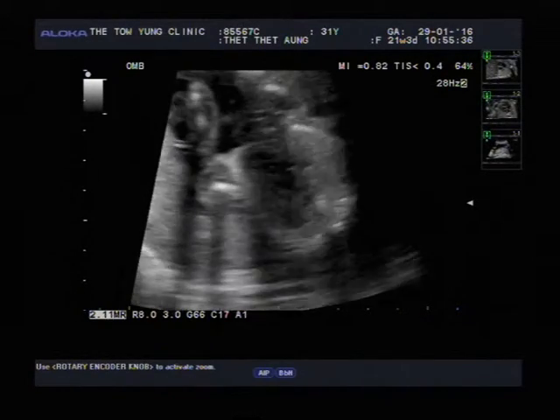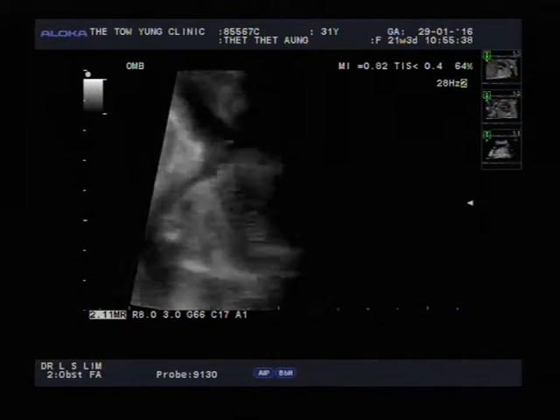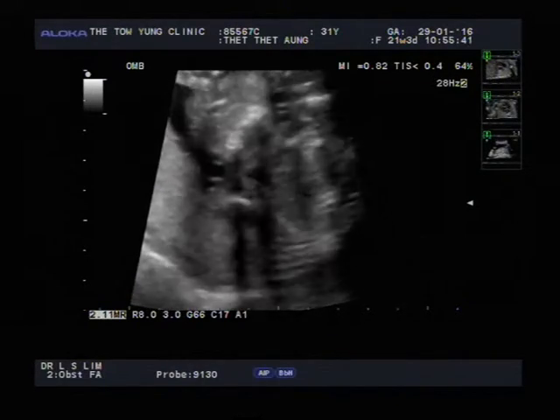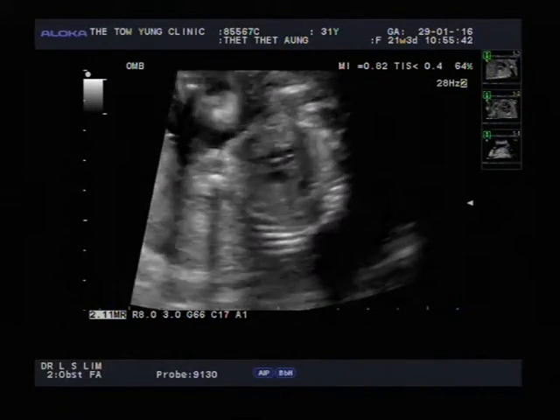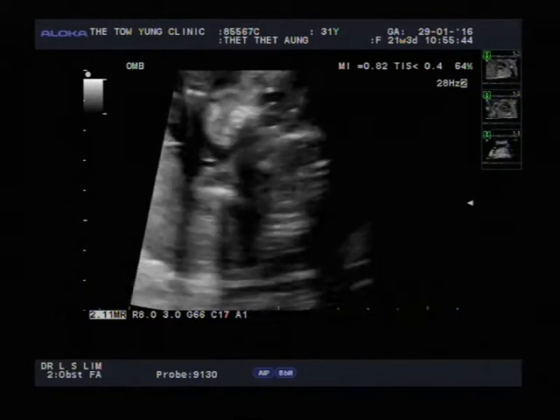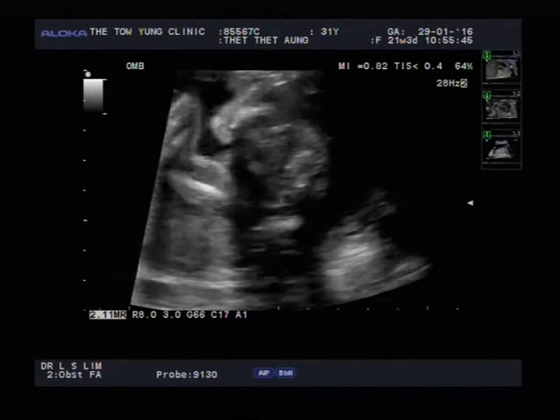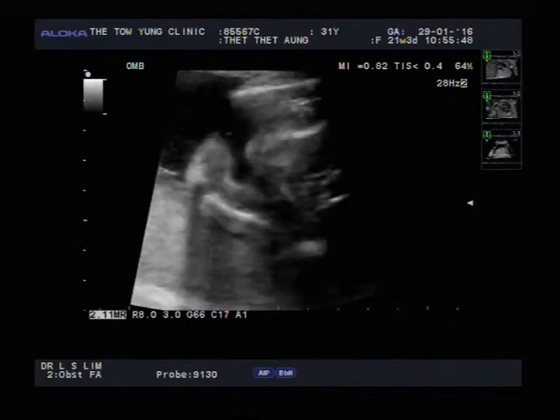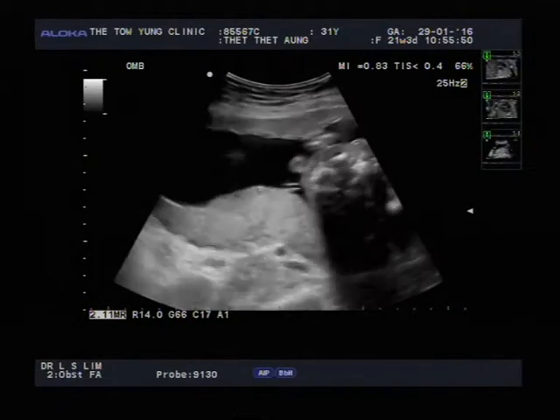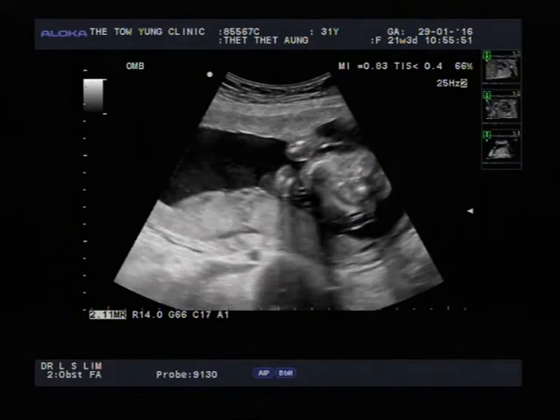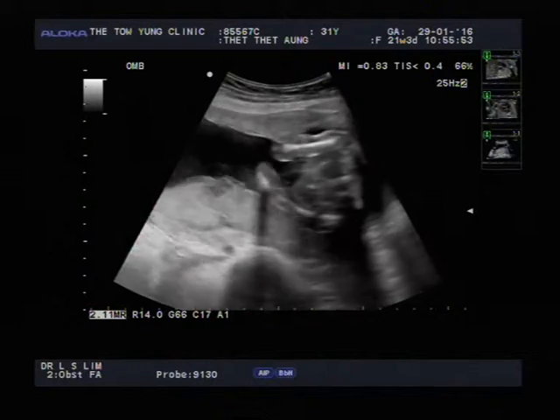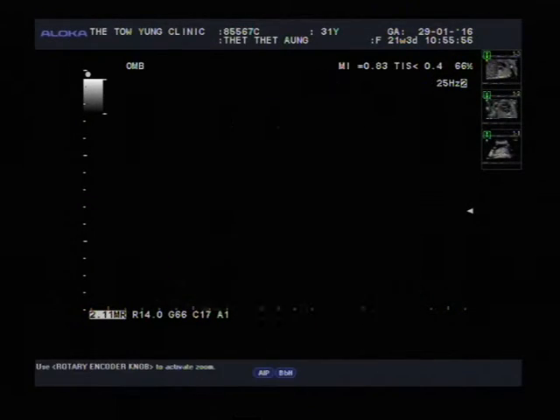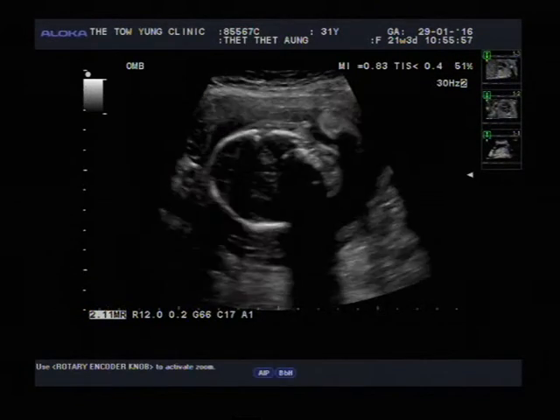The position of the baby has changed a little bit, so we're not getting such good views. I'm going to move on from here and come back to the heart later on. For the next view, we're going to look at the baby's face as well as the head and brain. I'm now looking at the baby's head and brain.